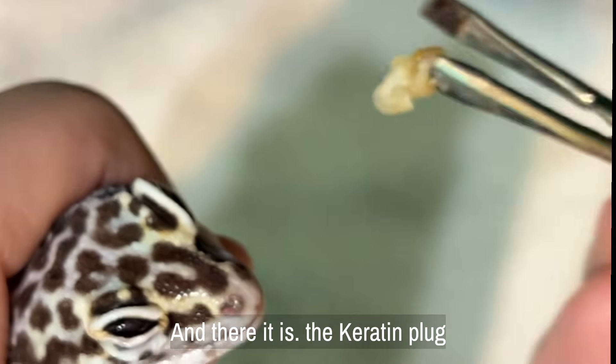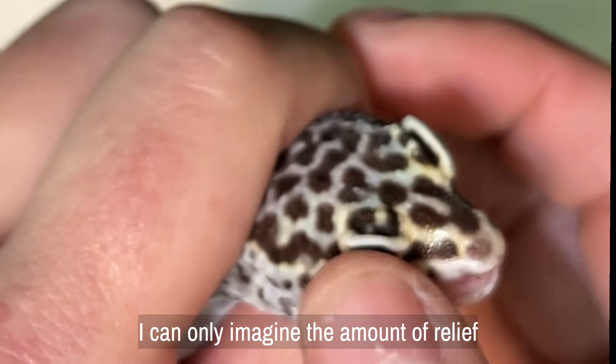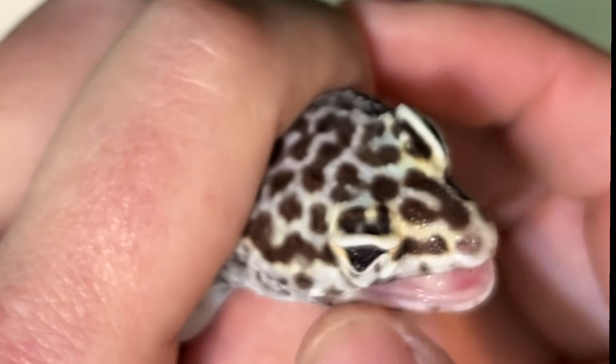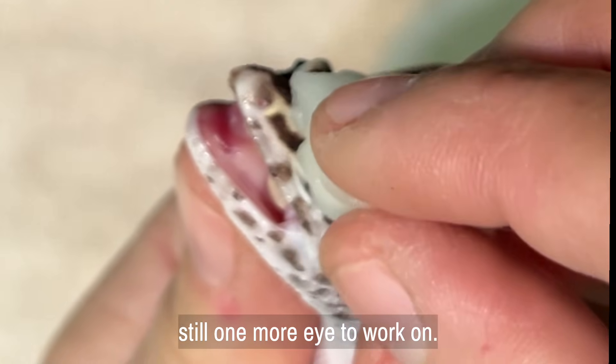And there it is — the keratin plug is removed. I can only imagine the amount of relief this gecko is feeling right now. But my work here is not done; there's still one more eye to work on.